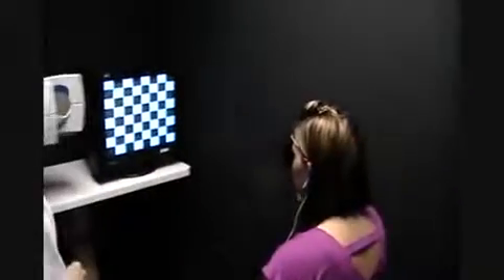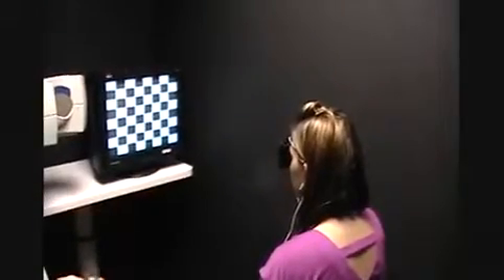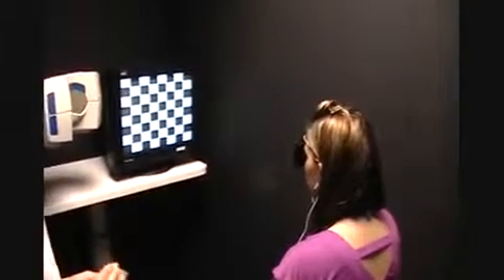And we're ready to start. She's going to put on an occluder, and we're testing one eye. And here is the checkerboard pattern. This is how simple it is.